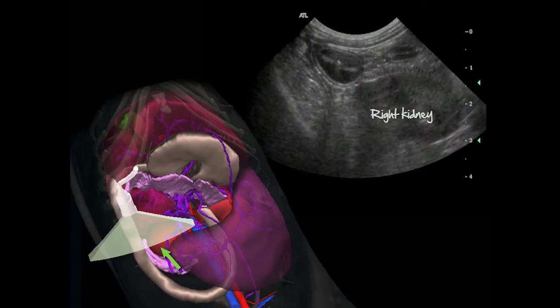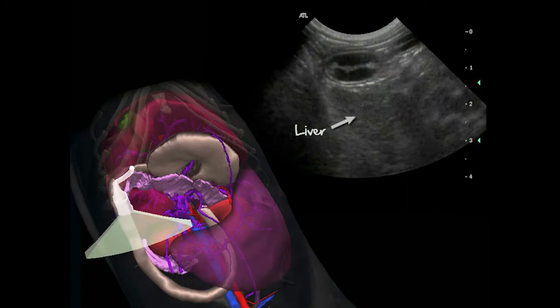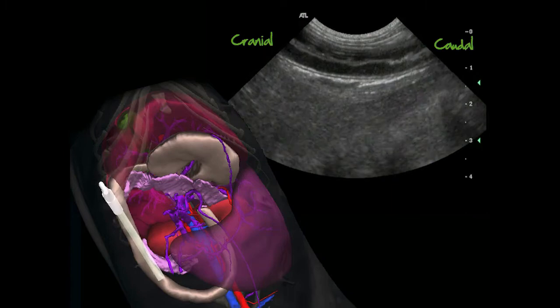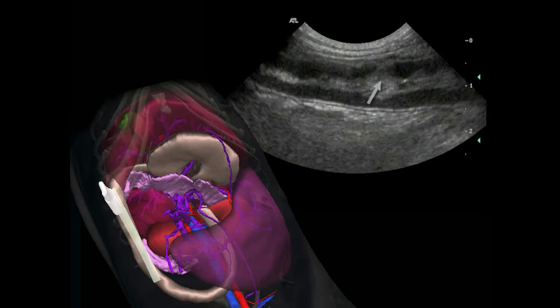Several organs are visible at each side of the duodenum during this scan. The probe is then rotated 90 degrees, with the pointer now facing cranially to get a longitudinal view of the duodenum. The layers can be examined again in this view. Note the depression in the ventral duodenal mucosa. This is one of the Peyer's patches, which are often prominent in young dogs.